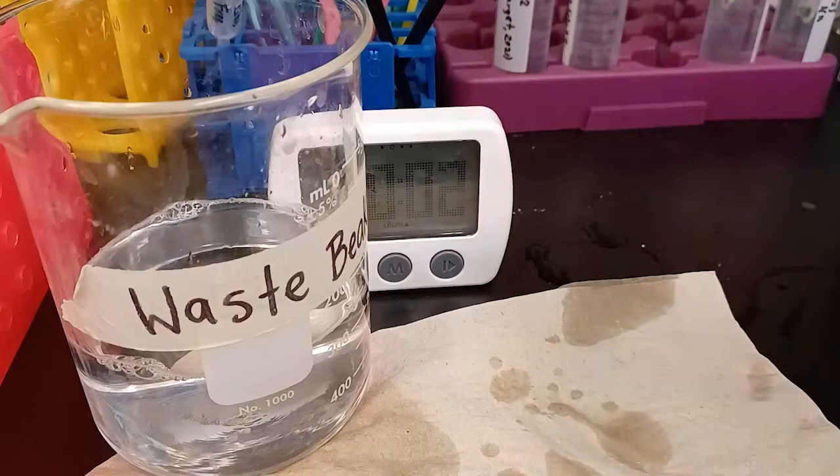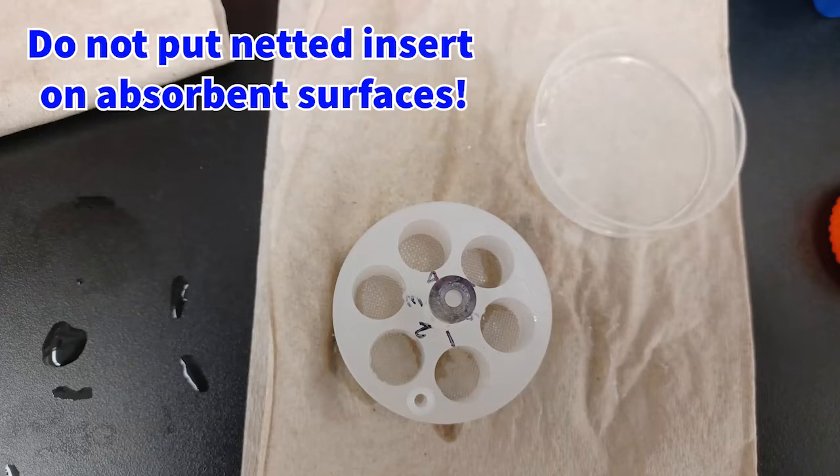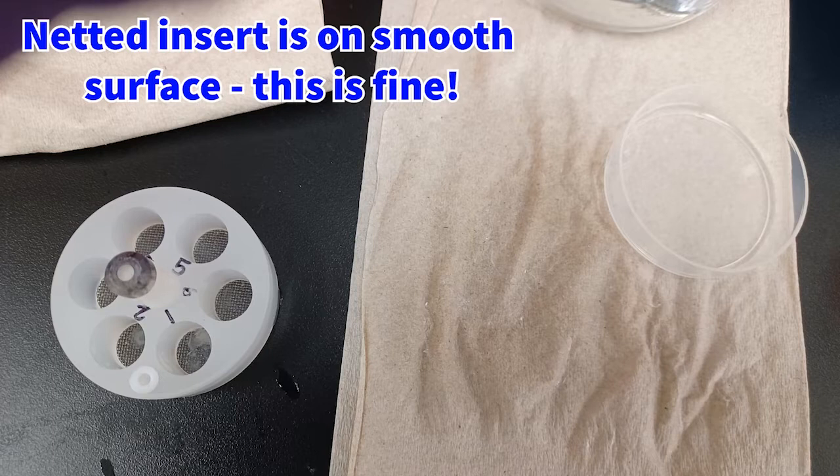Reinsert the netted insert into the basin. An important note for any time that you take your netted insert out to replace the solution in the basin: do not ever put the netted insert on an absorbent surface like a paper towel. This is not okay — it will suck all the water out of the sections and cause them to clump together. You want to avoid this.